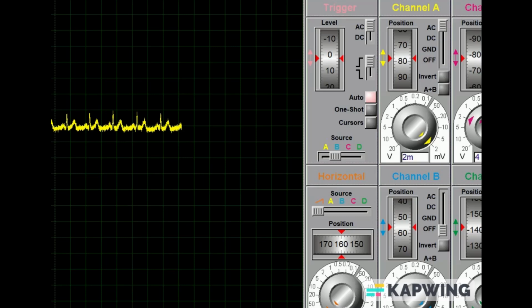The next step would be to pass a clean ECG signal through the filter to see how accurately it can be filtered. Here we didn't find any clean ECG, so as can be seen from the circuit and the oscilloscope, we have got a P wave, which is like a little notch, and a QRS complex that is high in amplitude, and the next is the T wave.